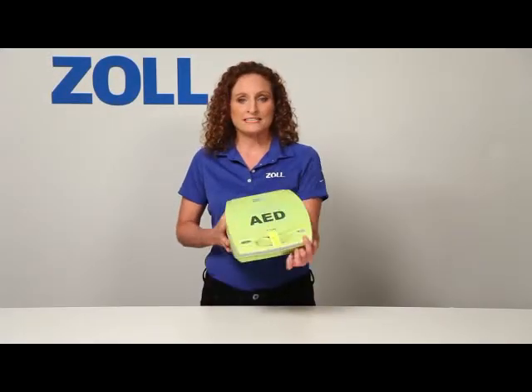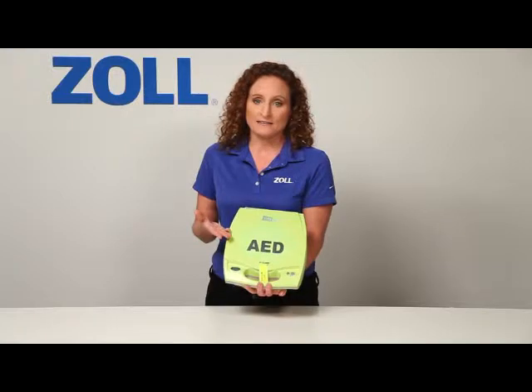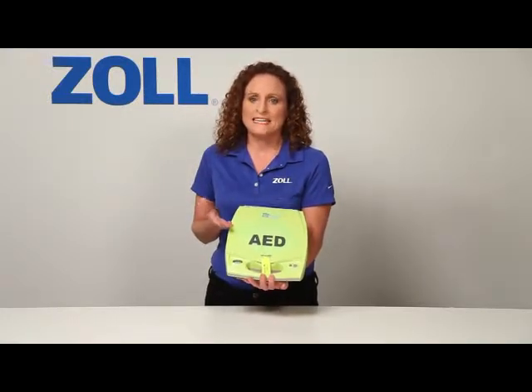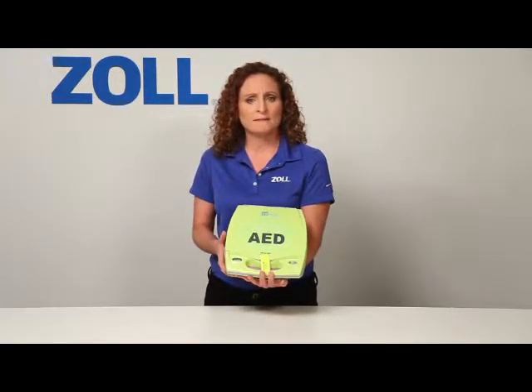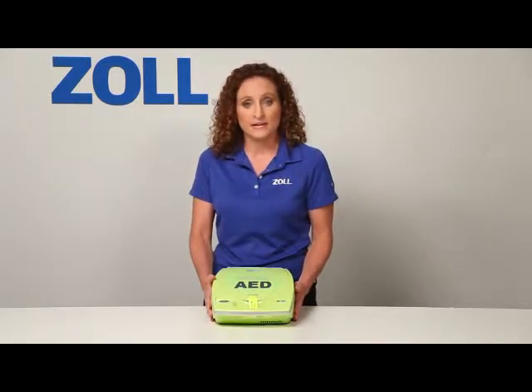Hello, I'm Leslie Zola from Zoll Medical, and this is the AED Plus, an AED that helps you all the time in every rescue. But don't most AEDs help all the time? Actually, most don't. At best, they only help about half the time.